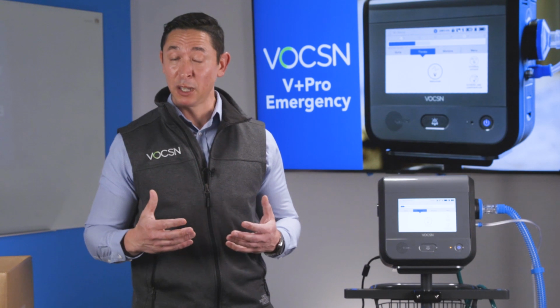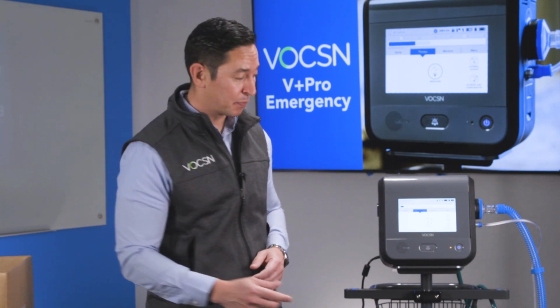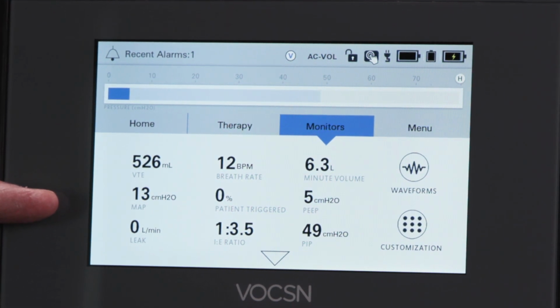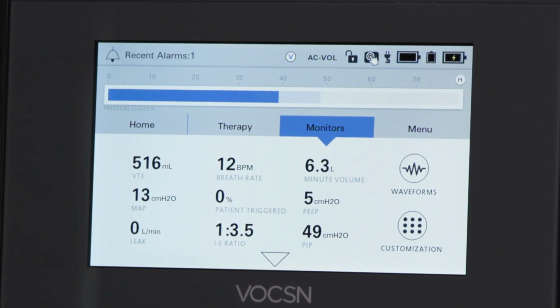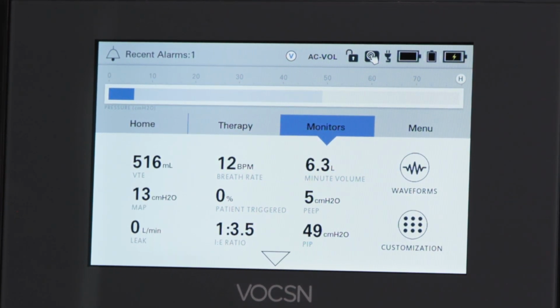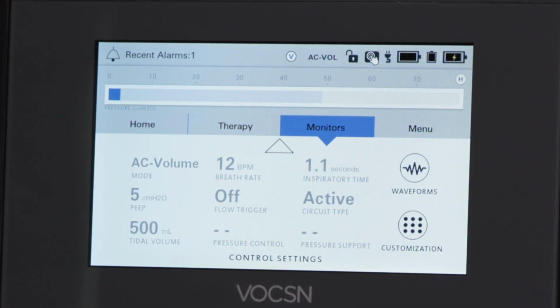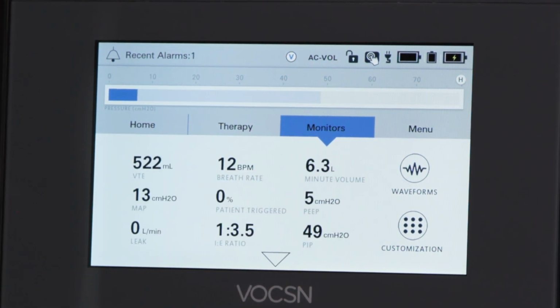So to do that, I'm simply just going to touch the monitors tab, which is just right there. So you have 9 patient feedback parameters. So think about your PIPs, your MAPs, your exhaled volumes. We also have this down triangle right here. That's gonna give you your control settings. So think about, what's my set rate? What's my set tidal volume? What's my set PEEP? So this way you can do a vent check by simply toggling back and forth. So I can hit this up arrow again.